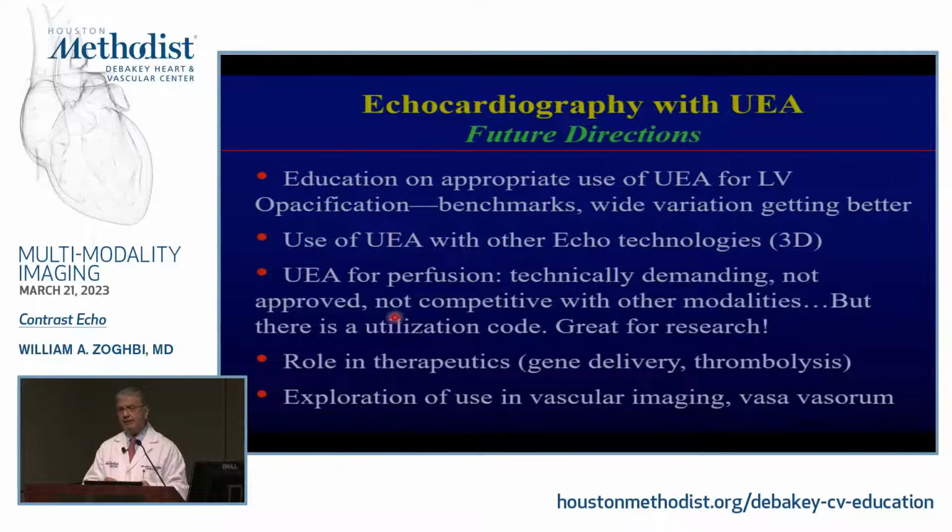Education, I think, is much better now than if you asked me 10 years ago, 15 years ago, although the agents are still the same. I think you could use it nowadays. Many of the trainees are very comfortable. Sonographers are comfortable with it. Wide variation is getting better. I'm talking about utilization in the country and in the world.